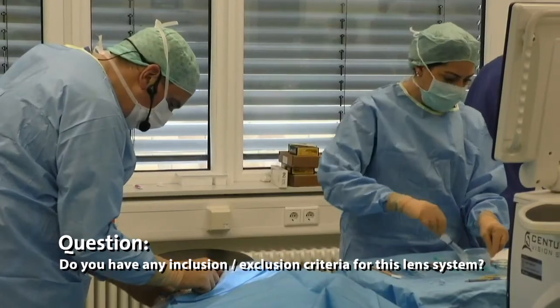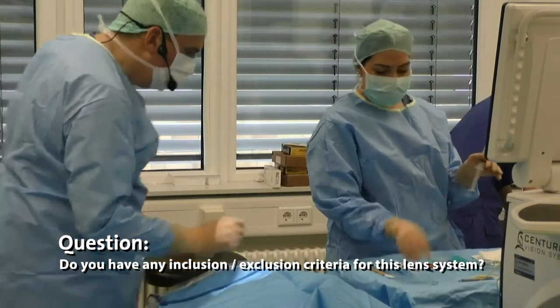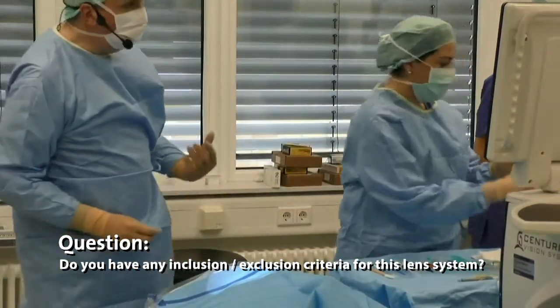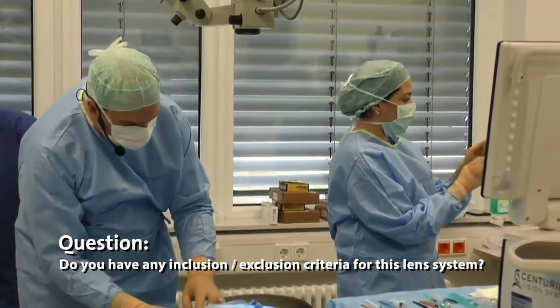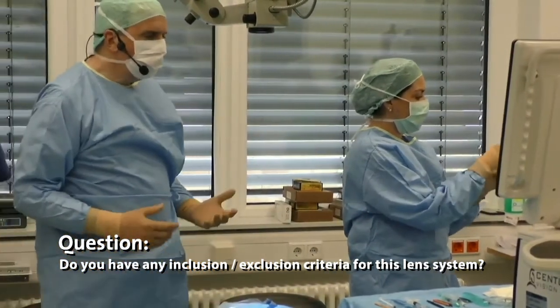There was one question, thank you for that, about whether I would implant a multifocal add-on IOL in a patient who already underwent a YAG laser capsulotomy. I would answer this question with an absolute yes. If you have a stable intraocular lens, let's say 10 years after cataract surgery, there's no need to be afraid of an additional implantation. Do you have any other inclusion-exclusion criteria for this lens system? Only the depth of the anterior chamber, maybe some other pathologies inside the eye. I cannot remember one where this was the case, but no.